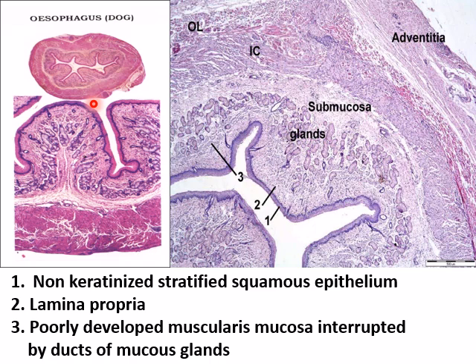Look please at the lining epithelium. The lining epithelium is non-keratinized stratified squamous epithelium. How do I know it? It has a clear wavy basement membrane, and I'm having nuclei of different shape: first columnar oval nuclei, then many rounded, then flat nuclei. Okay, look here, dear students.